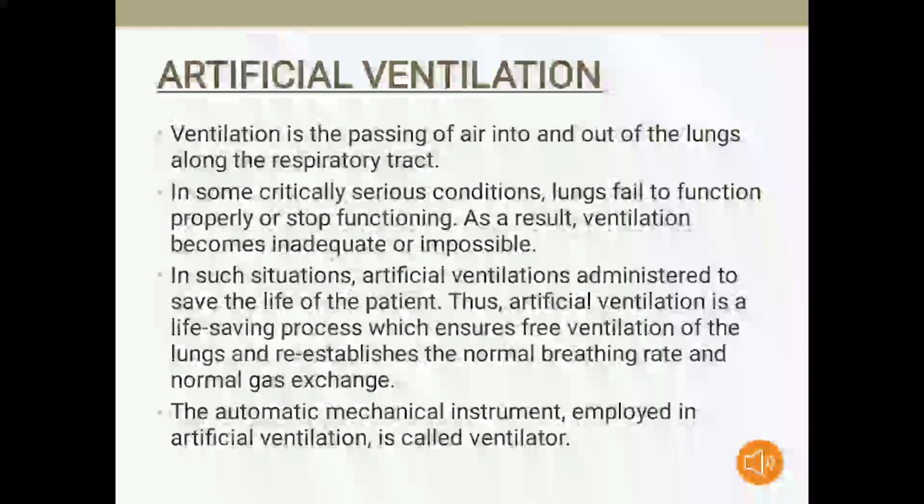So, what is ventilation? It is the movement of air in and out of the lungs along a respiratory tract. And in some serious conditions, lungs would stop functioning or they would fail to function properly. So, as a result, we have to administer artificial ventilation to save the patient's life. Thus, artificial ventilation is a life saving process.